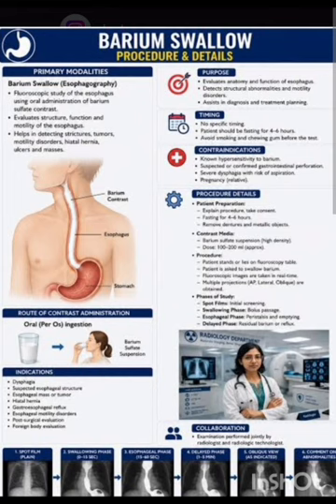Then move on to the procedure. For every investigation, this procedure is important. On the day of the examination, the technologist should describe the whole procedure to the patient and obtain written consent from the patient, permission for the procedure. The patient is asked to remove clothing and wear a hospital gown.